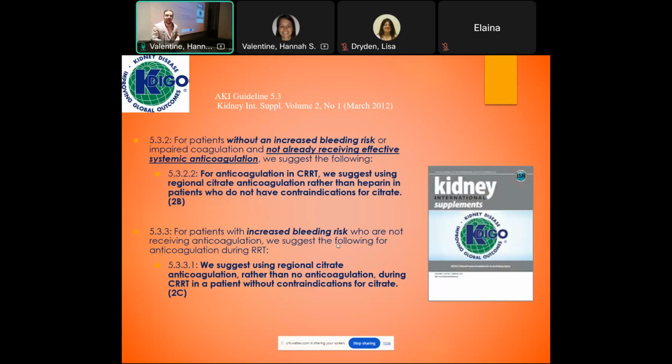Now, when the filter goes down, Ellie, how much time does it take for you to put it back together? 30 minutes? Now, 30 minutes? You're on this end of the spectrum where you're very good. On an average, it's 45 minutes or so, right? And that is an uninterrupted 45 minutes. How often does that happen in the ICU? Not very often, right?